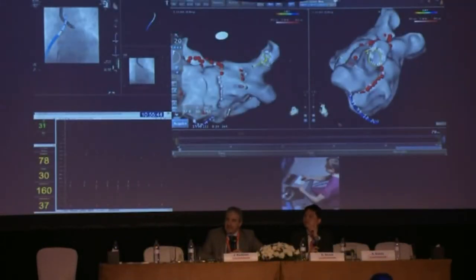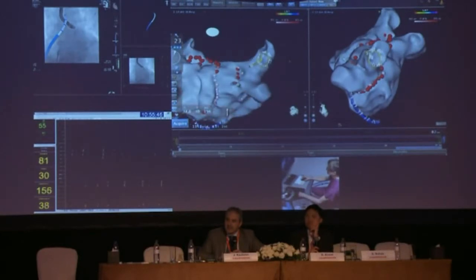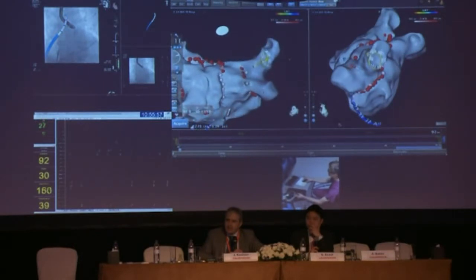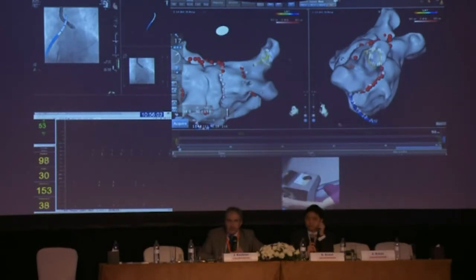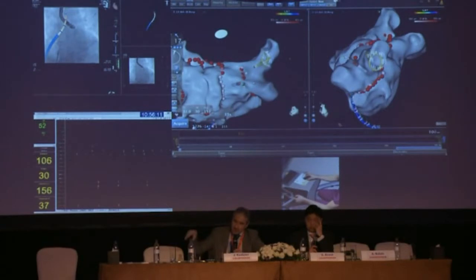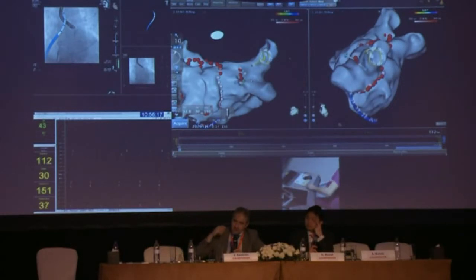There is one more question. In some patients, when you ablate around the pulmonary vein, at a certain point all potentials disappear. Of course, you know this. Do you have an explanation for this? At a very special point, you find that all potentials disappear. How do you mean, during ablation? Yes. Oh, you mean if you reach isolation and there are some potentials? No. Sometimes when you are doing ablation around the lasso, at a certain point, in spite of having potentials all around the whole vein, at one point everything vanishes and they never recur.